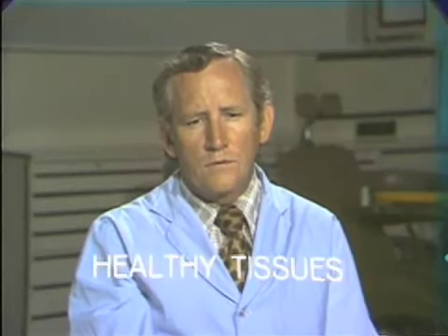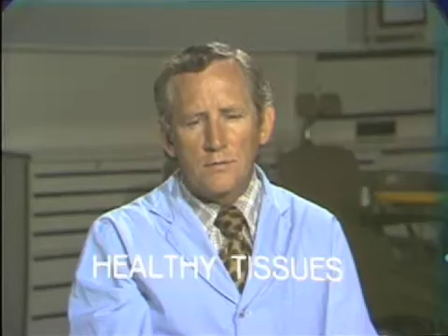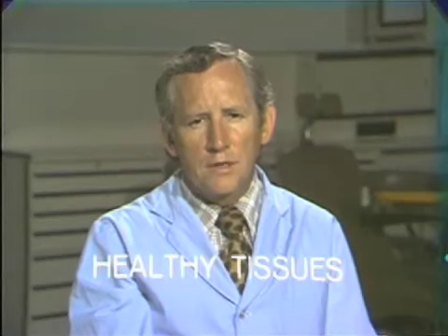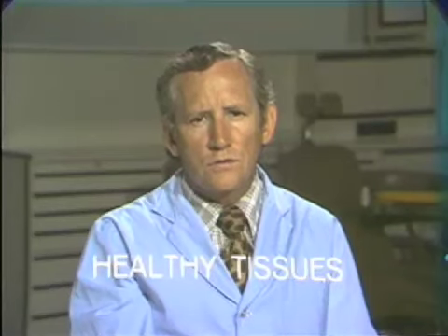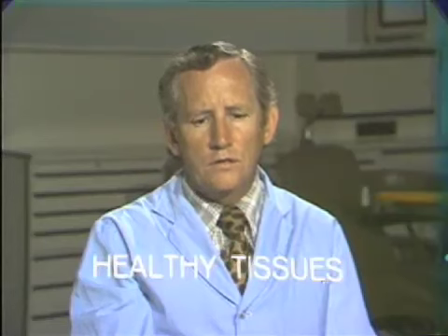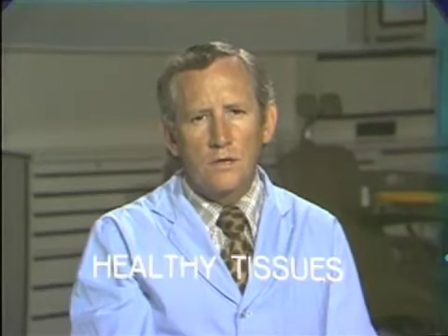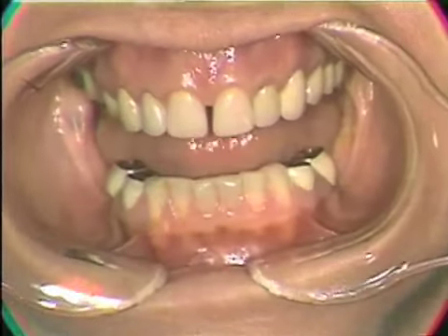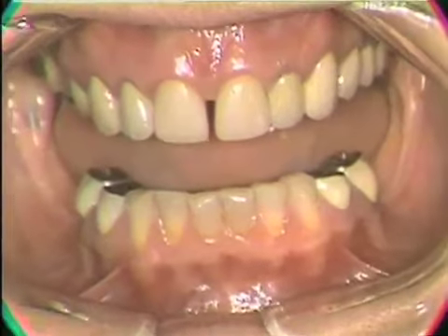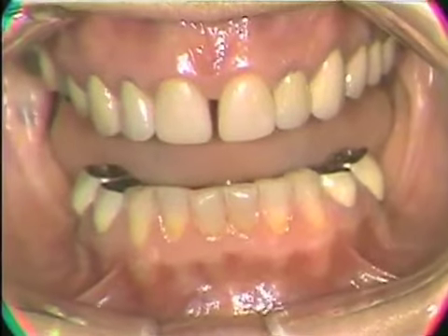Also, we would want to leave the appliance out, especially if it's an ill-fitting or unstable appliance, because the appliance can distort the tissue. We would want to allow the tissue to come back to its normal resting form before we took the impression. So it's important to establish the healthy tissue before we take the impression. So we want those supporting tissues as near a normal condition as we can.